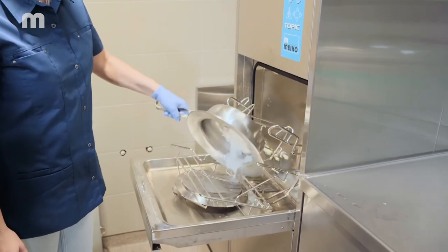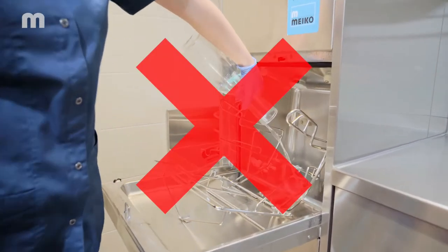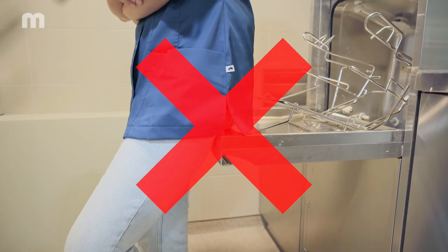Bedpans and urine bottles must not be emptied manually beforehand. The bedpan washer disinfector is not a chair — please do not lean on it or sit on the lower door.